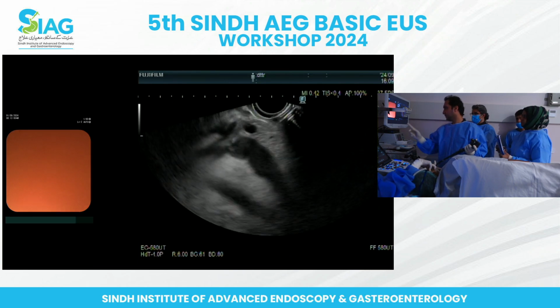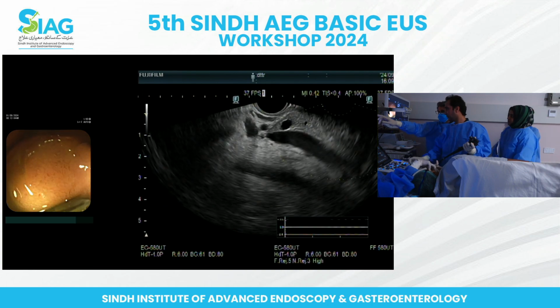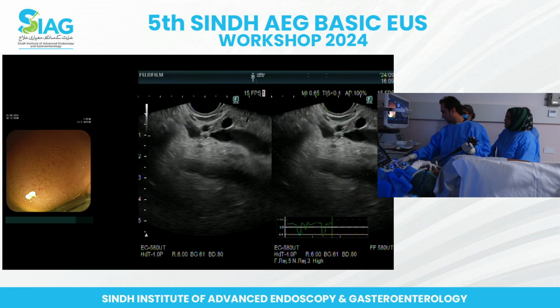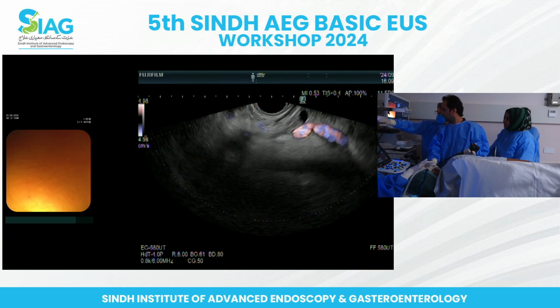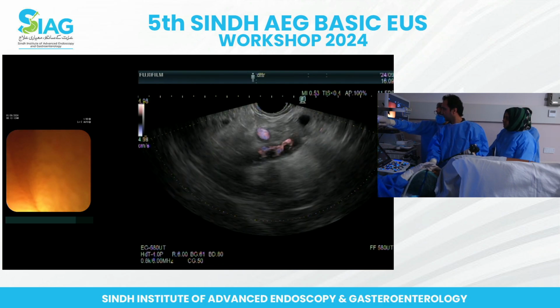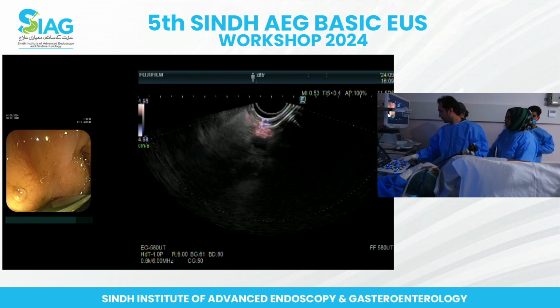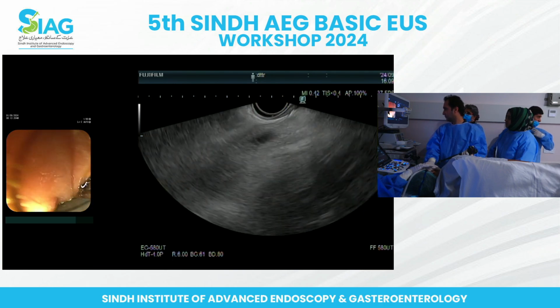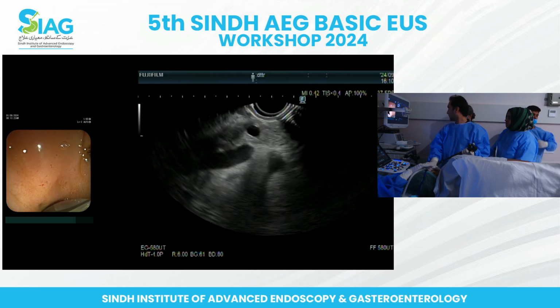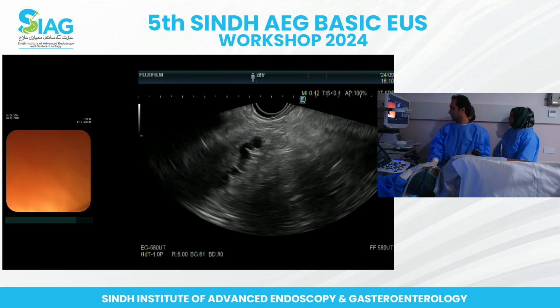Yes, so you're now on the portal vein, the PD, hepatic artery, and the bile duct at the top. Yeah, very nice. So bile duct, you can see the double layered wall structure. Pancreatic duct, portal vein, hepatic artery. Very nice. What a nice view of the pancreas. Doesn't matter. Don't worry. You've got really nice control. I'll keep it here. We should be able to do the sample from D1.